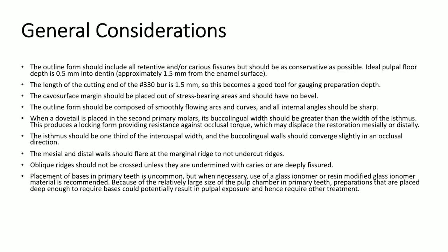General considerations for this procedure include: the outline form should include all retentive and/or carious fissures, but should be as conservative as possible. Ideal pulpal floor depth is 0.5 mm into dentin, or approximately 1.5 mm from the enamel surface. The length of the cutting end of the number 330 burr is 1.5 mm, so this becomes a good tool for gauging preparation depth.